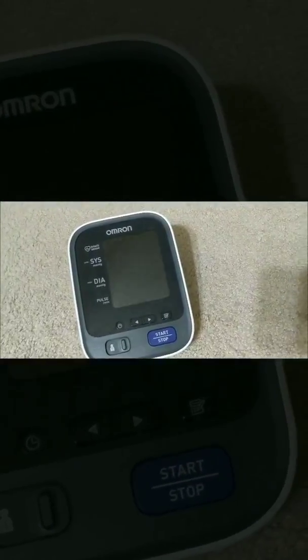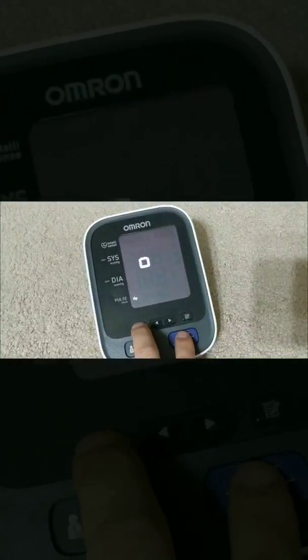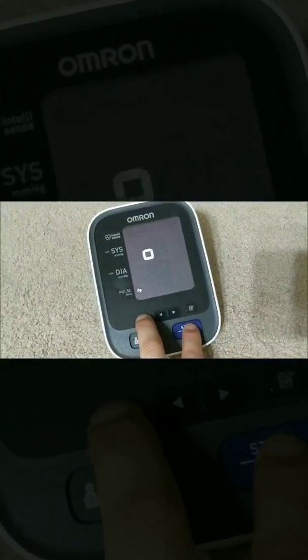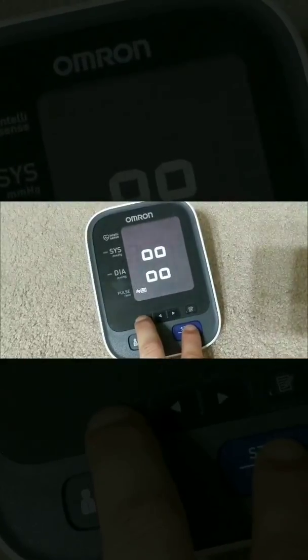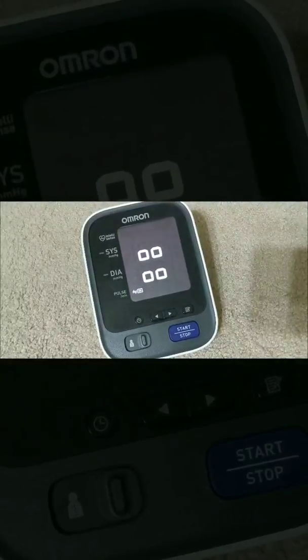To start, we're going to make sure that we tell the blood pressure monitor to unpair. That's done by holding down the clock and the start and stop for a few seconds until you see these four flashing O's.